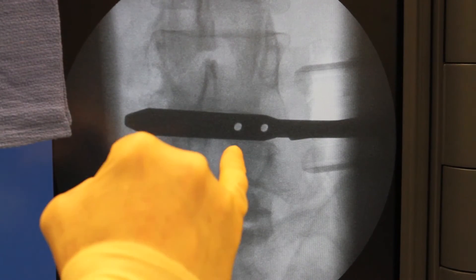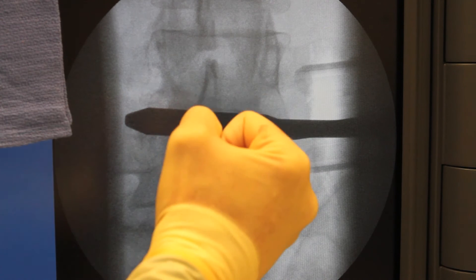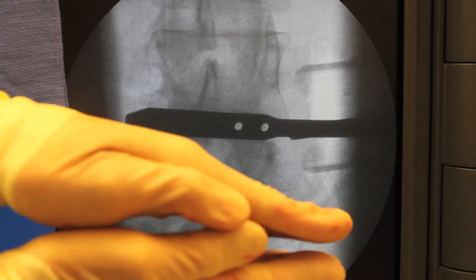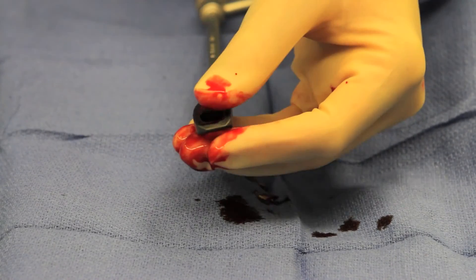This is an eight-millimeter trial. These marks tell me what size cage to use — in this case it's going to be a 50-millimeter cage, eight-millimeter height, and I'll choose the AP dimension. You can see how the disc space has now been distracted open. An appropriate size cage is filled with bone graft material.